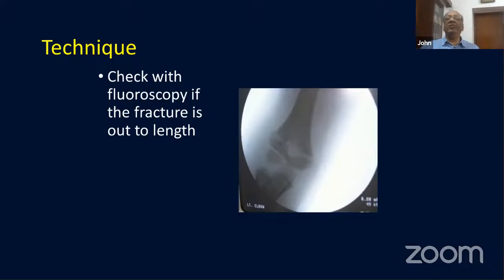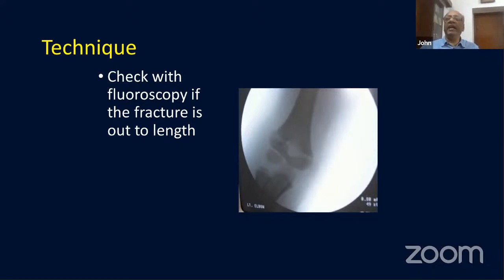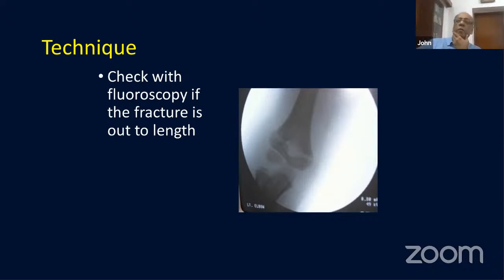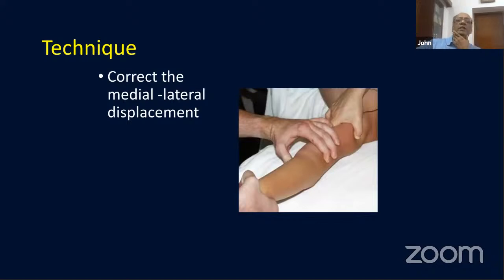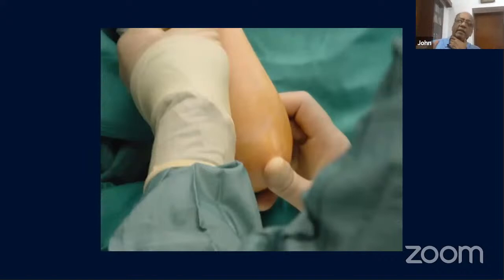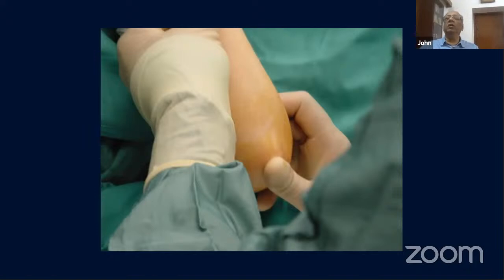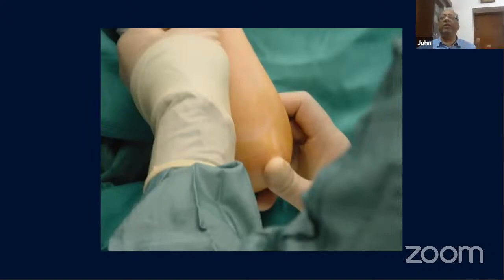Give longitudinal traction to get the fracture out to length — be patient, it may take a couple of minutes of traction. Check the medial-lateral reduction once out to length, then correct medial-lateral displacement and flex the elbow with your thumb on the olecranon to push the fragment forward. In an extension-type fracture you need to flex the elbow quite a lot to get a good reduction.